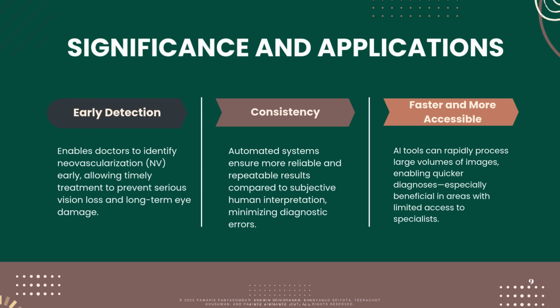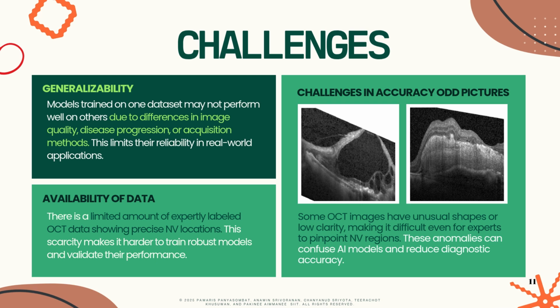since it is a tool, it can reduce the doctor's workload and help the doctor identify the disease quickly. The challenges. The first challenge is generalizability. A model trained on one dataset may not perform well on others due to the quality of the image, disease progression, or the acquisition method, which will affect a lot when training and preparing the data.